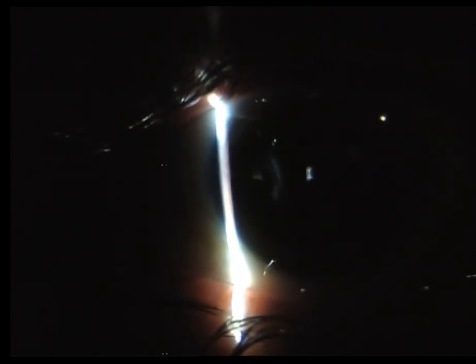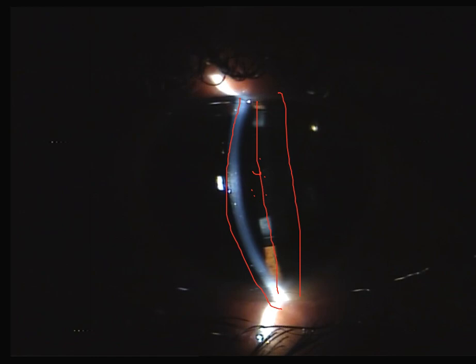Move the slit from one side and come to the other side, looking at the anterior chamber depth on each side. While looking in this area, you need to look for cells in the anterior chamber. This is the slit from behind and this is the slit from the front, positioned at this area - check if it's being highlighted by the slit lamp.